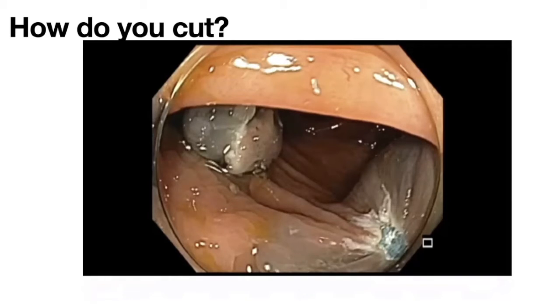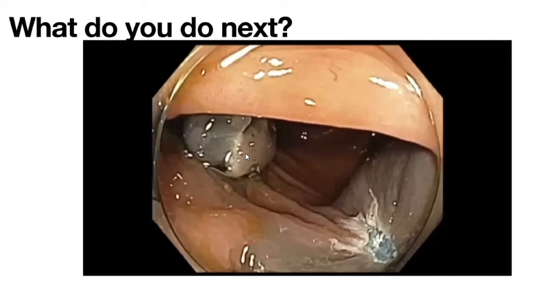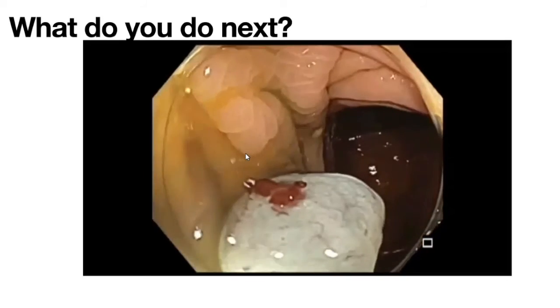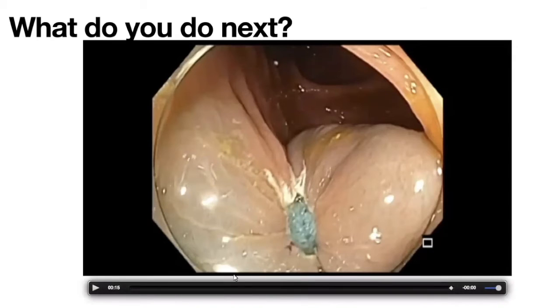So any comments on the resection and the margin? And why don't I go to the next slide? Okay. So one thing is, I want to ask Noria whether they would suck the polyp as we have done, or would they wait and get it through a net when you see something like that? So maybe in this size, we also use the suction trap. Yes. Okay. In my practice. Right. And do you want to comment on the base and the edge? I think it's clear. No remnant. Right. Looks like.